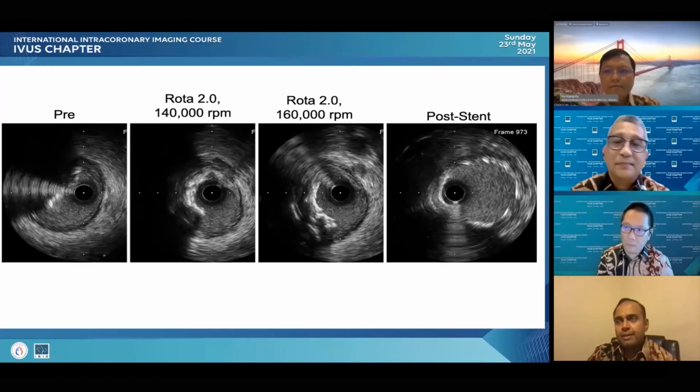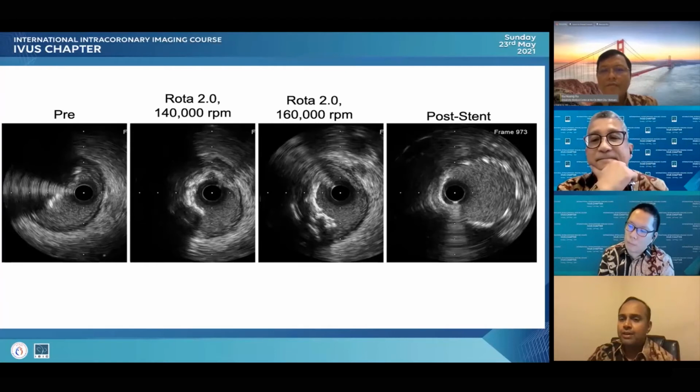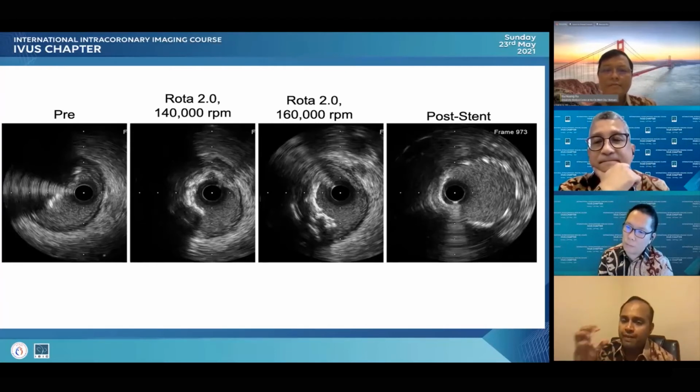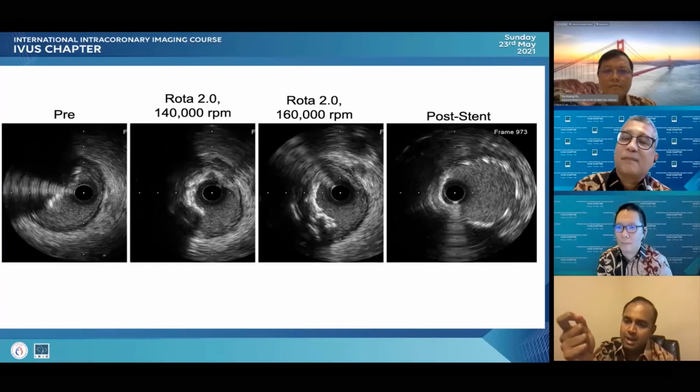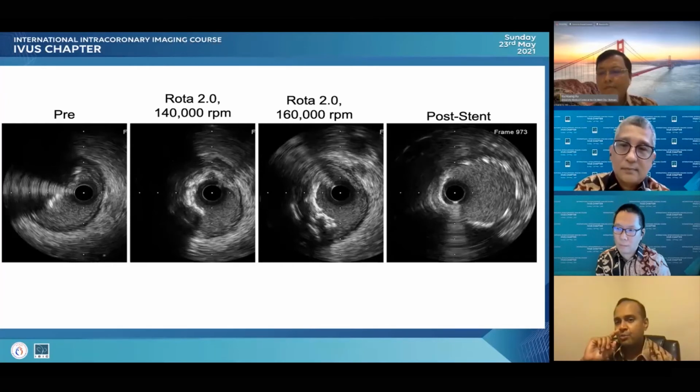So wire bias is a difficult issue, especially for calcified nodules. In general, we would try to change to a rotastiff wire, for example, to see if there is a more favorable wire bias. Sometimes even that does not give you a favorable bias, and you may have to maneuver the wire, pull on it gently or advance it gently just before you start the burr going. That sometimes can help change the bias in the vessel as well.